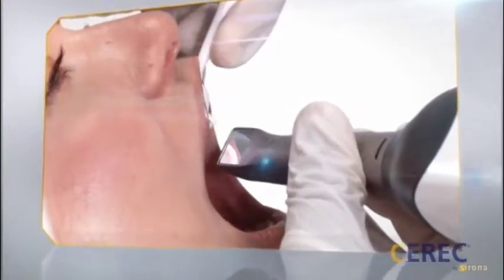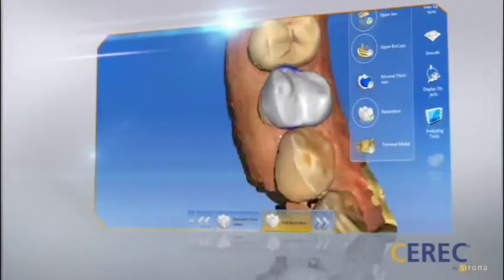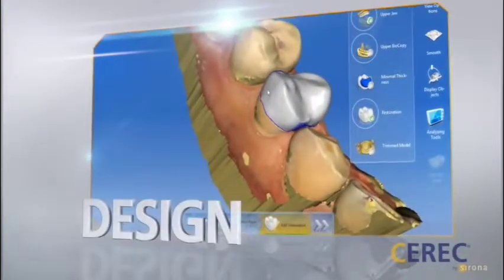If there really was a drawback, it may just be the time involved. Because we have the whole process to do from start to finish in a few hours, I mean, we really have to once we're done preparing the tooth, we're not just temporizing it and sending it off to the lab.